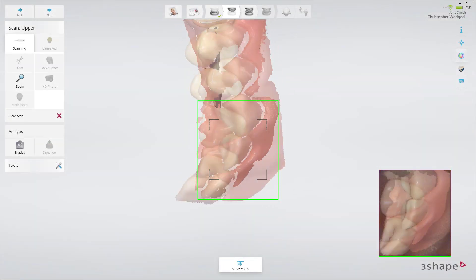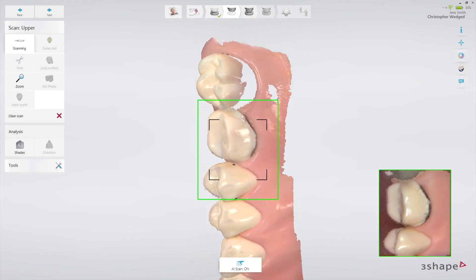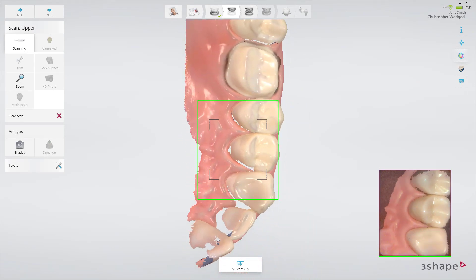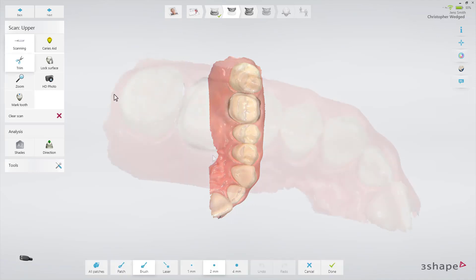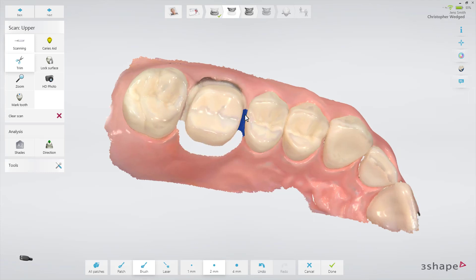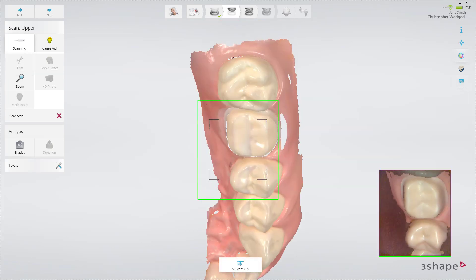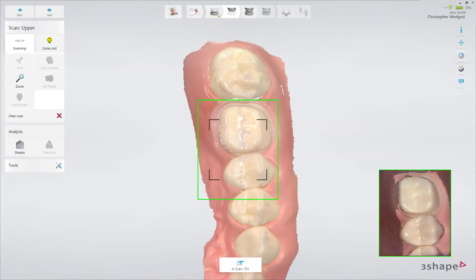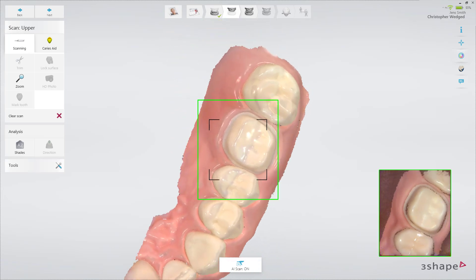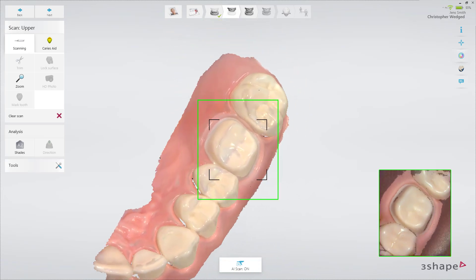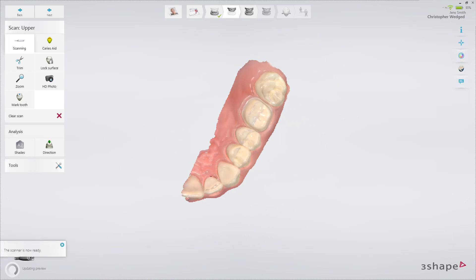The second option is to leave the retraction cord in place and scan the arch following the scan strategy. Then trim away the margin in the scan with the trim tool. Remove the retraction cord, dry the teeth, and scan the margin immediately before the gingiva collapses. No matter which method you prefer, make sure that you've covered the prepped area entirely, including the margin line and contact points.